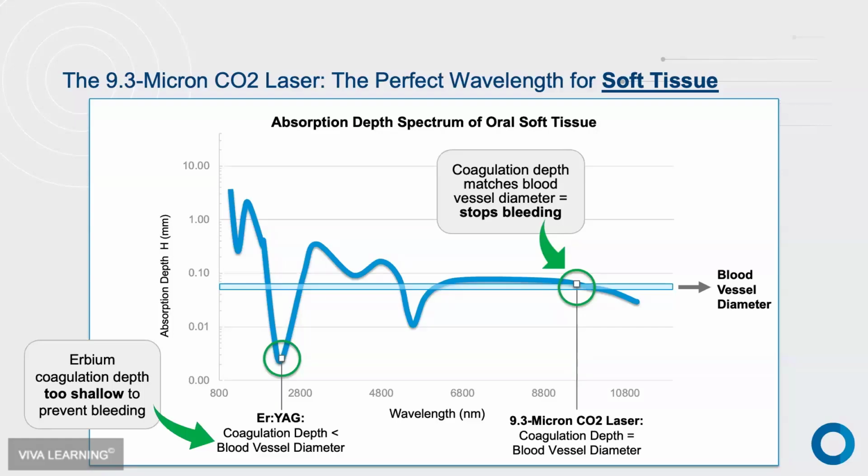Now, I actually have a video of this kind of effect. One of the things with the laser is when we do training here in Santa Barbara, we actually will have pig jaws for doctors to use to practice different perio procedures, crown lengthening, surgical incisions, fibroma removals, frenectomies. So we'll practice all that. And one of the pig jaws I was using at one point was just kind of drying out a little bit, but still had enough moisture left to kind of show a nice cut.